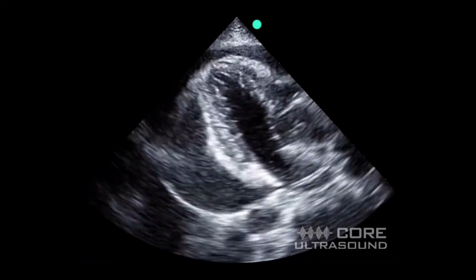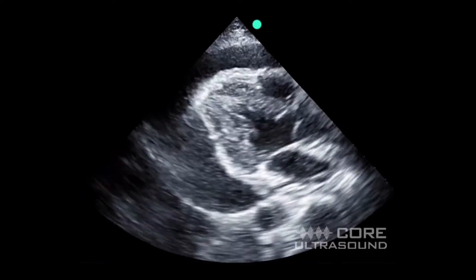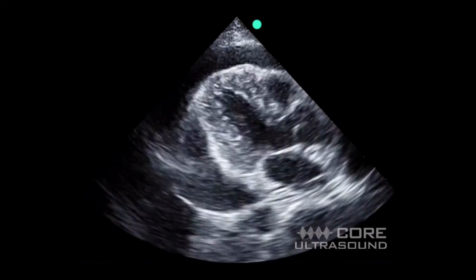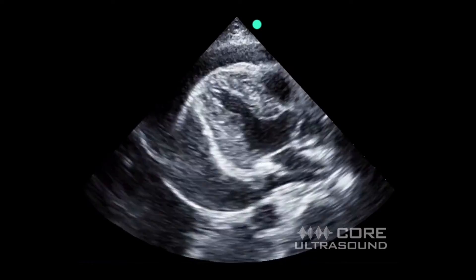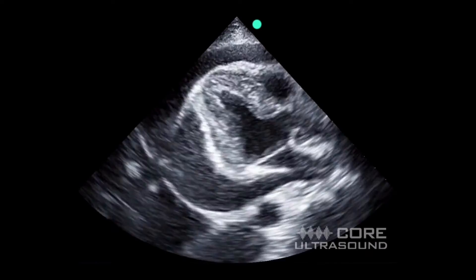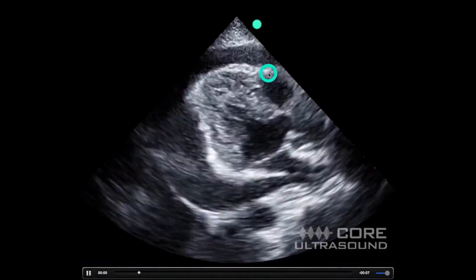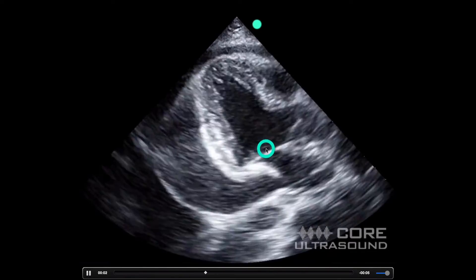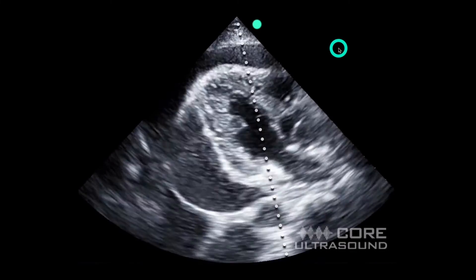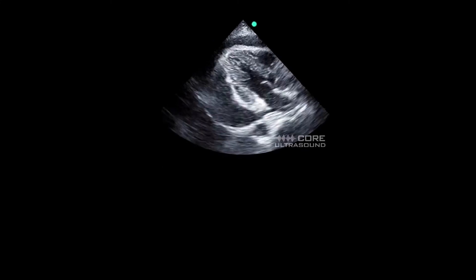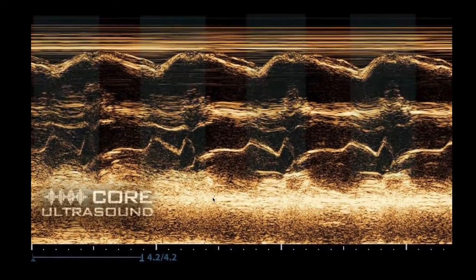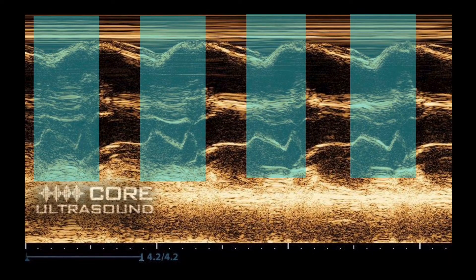The parasternal long axis view when looking at tamponade is very useful because you can tell exactly when in the cardiac cycle the collapse of the right side of the heart is happening. You can slow it down and see that this collapse of the right ventricular outflow tract is happening when the valve is open, but you can also put an M-mode cursor through there — just like you do for EPSS. You can see diastole, systole, diastole, systole, and confirm that when the valve is open and the RV is trying to fill, that's when the collapse of the RV free wall is happening.